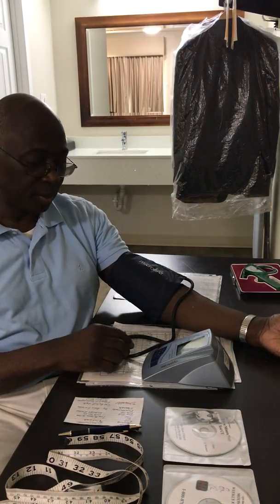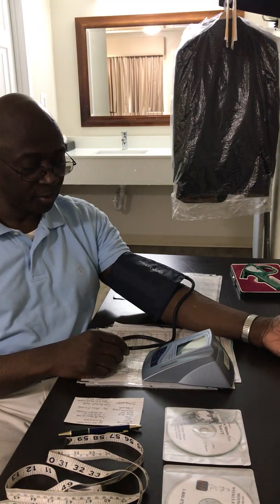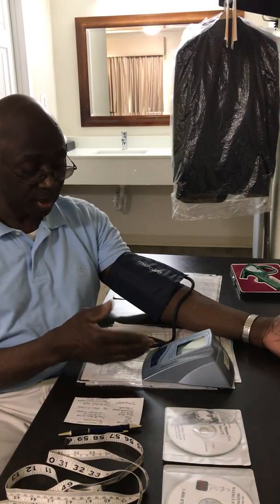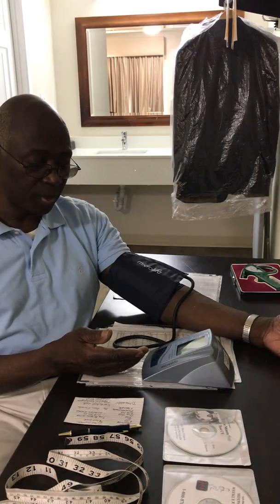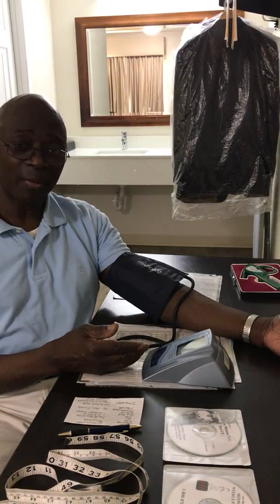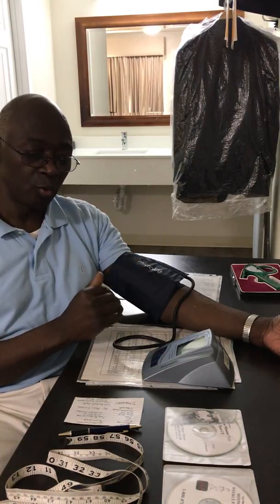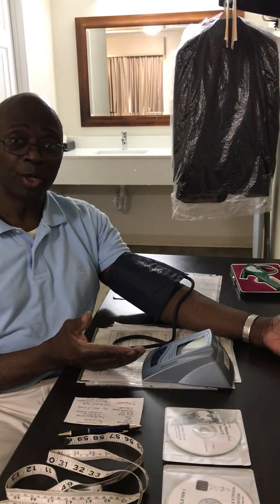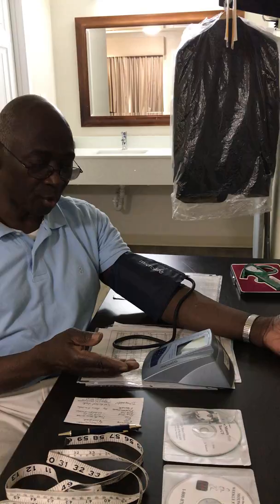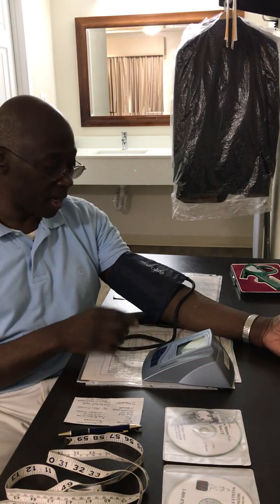Wait until the cuff fills up. Some people use this to try to determine their exercise heart rate, which is a bad idea — when you stop exercising to take the reading, your heart rate is already coming down, and by the time the machine gives you a reading it's changed so much that it's not usable information. So this is not a good way to test your heart rate while exercising.